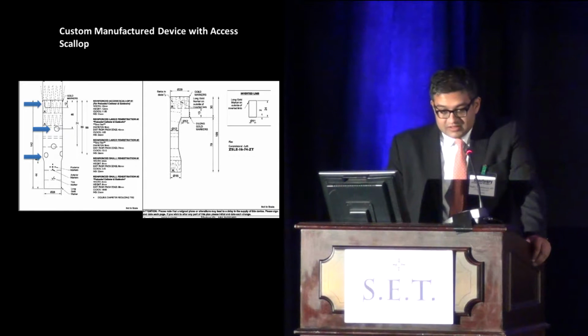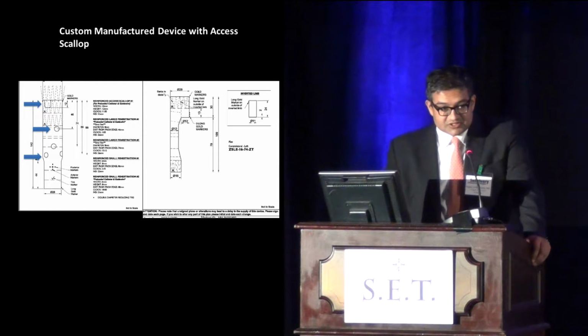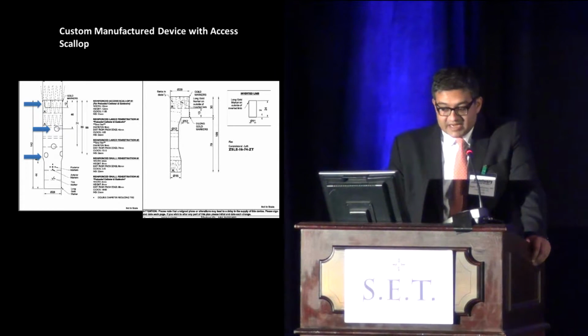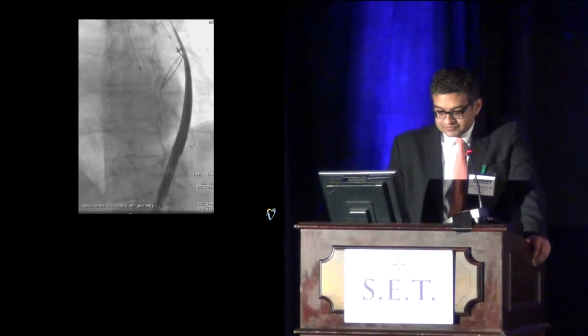Also of note, on the right, you'll see an inverted limb device, which is used to treat these patients with short main body grafts and has an inverted limb to be able to hold the device because there's not a lot of room in these patients.